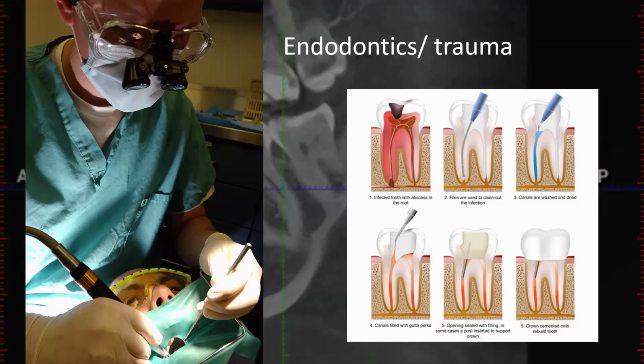Their newer machine, their biggest advancement is lowering dose. And so that's great for implant planning for most cases. But that machine, I would say, is not the best for endodontics. If you're looking for a fracture in a tooth, in most cases, you're not going to see a fracture, even if there is one. We'll talk a little bit later about resolution, but the highest resolution we've been getting from CBCT is really about 0.3 millimeters, which is in most cases not high enough resolution to see a fracture.